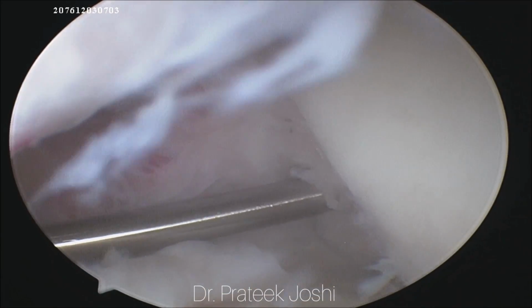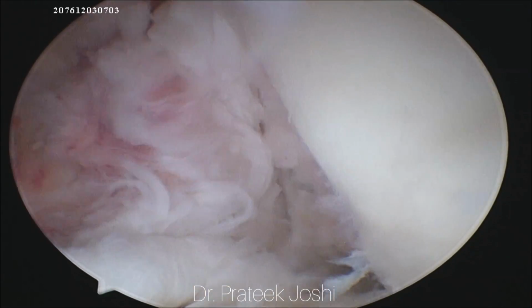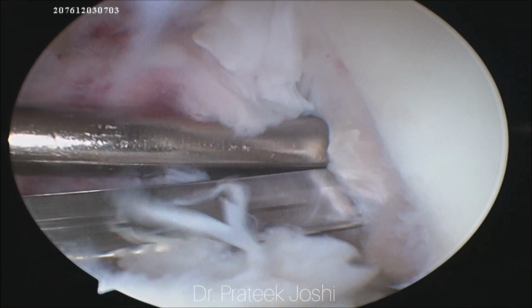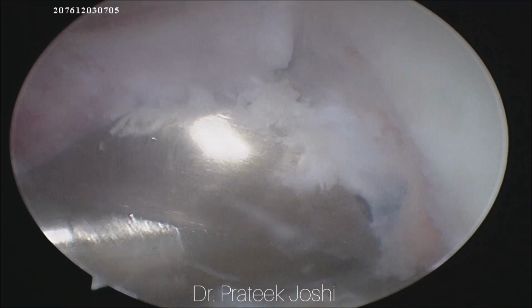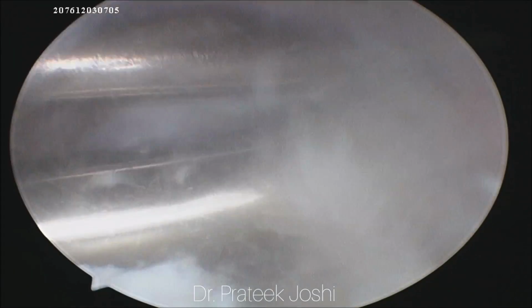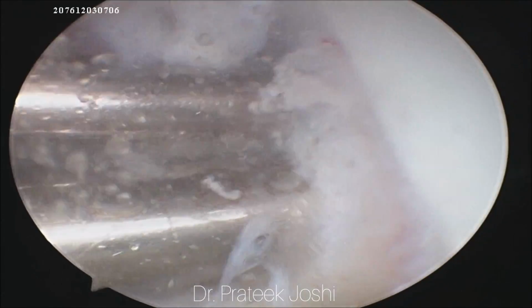Now I am going to remove the guide wire and introduce the depth gauge, and the depth of our femoral tunnel is 35 millimeter. So here we are going to use adjustable loop endo button, for which we are going to keep 20 millimeter of graft in femoral tunnel. So we are going to drill with 10 millimeter drill bit up to mark of 20 millimeter, because the diameter of our graft is 10 millimeter.